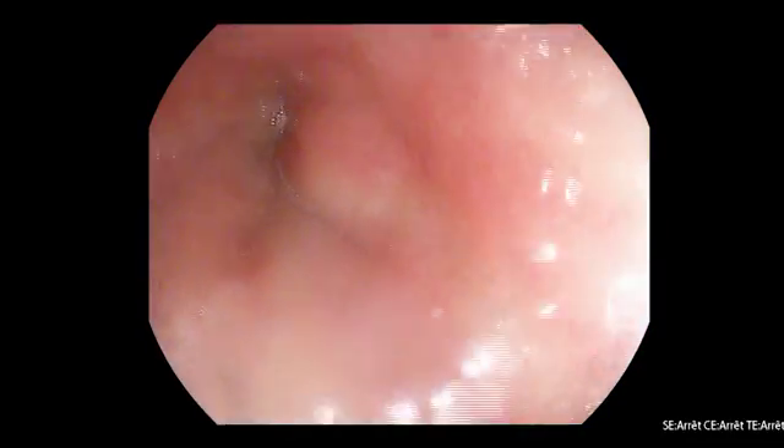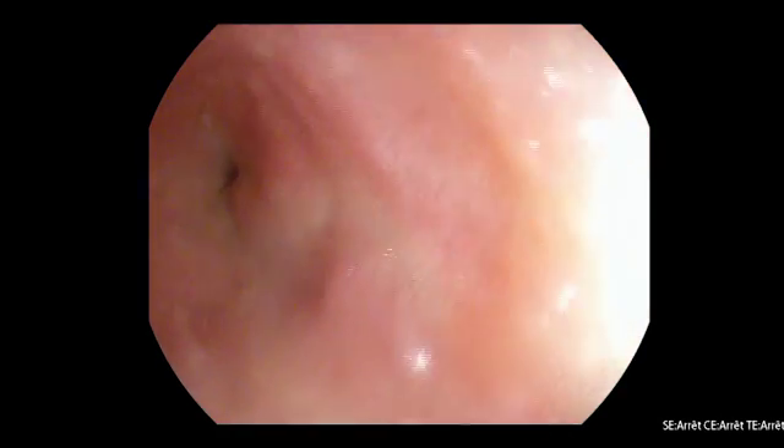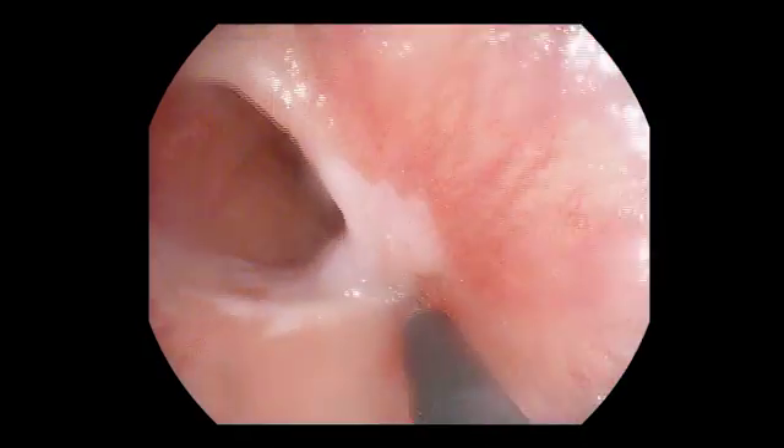I will start by the injection, because I like to inject — even if it's not recommended when using the DUET system. I will start by the injection. You can inject.